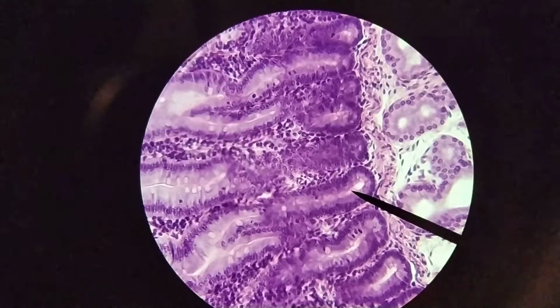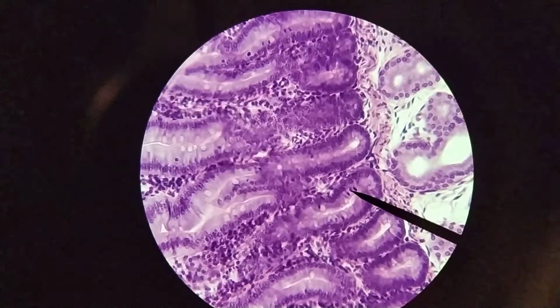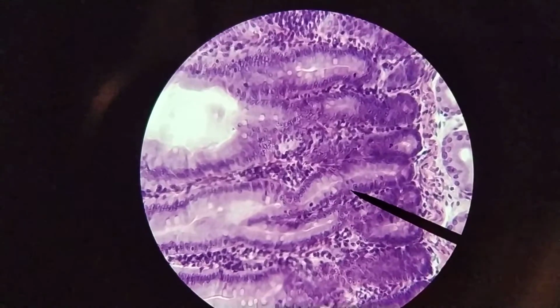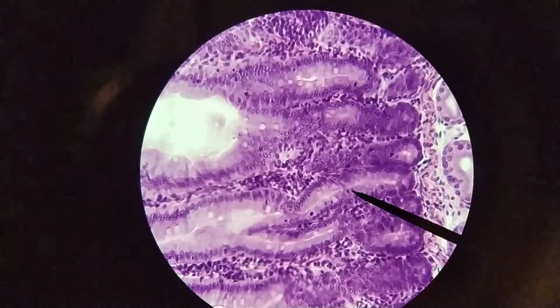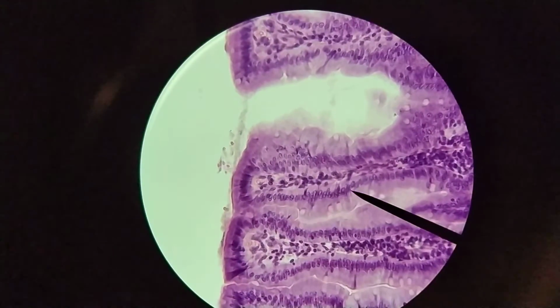Here's the lumen. Okay. One of the things that we tend to see in the crypts of Lieberkühn is evidence of cell division. So here we have evidence of mitosis showing up. Again, we see that here as well. Okay. What we tend to have is a lot of stem cells in these crypts of Lieberkühn, and that's because the epithelium on the surface is replenished fairly frequently.